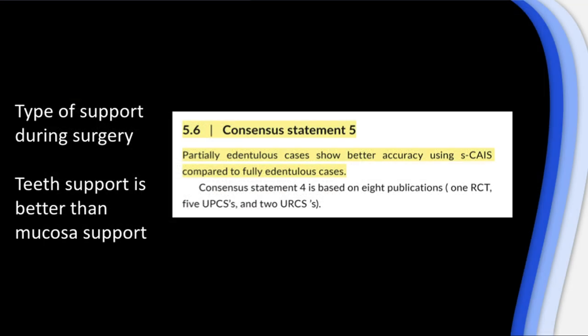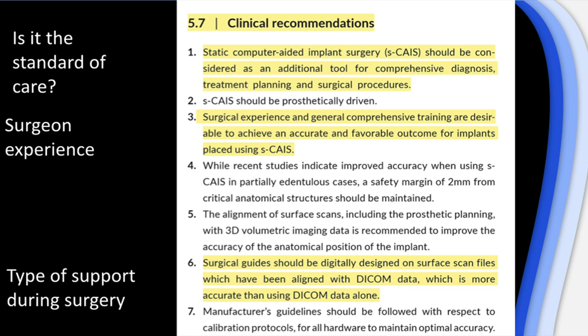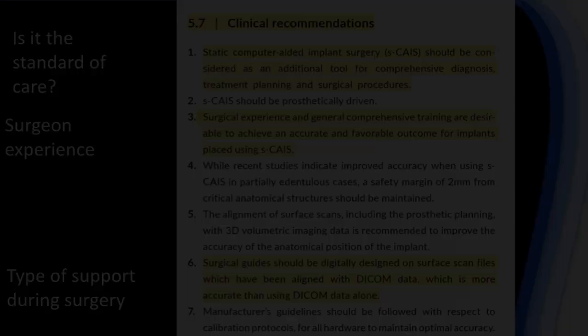Also, the type of support during surgery is another factor which dictates the degree of accuracy. It is well documented that tooth-supported guides offer more accurate results than mucosa and bone-supported guides. It's recommended that the surgical guides should be digitally designed on a surface scan model rather than on DICOM data. Moreover, the surgeon's experience is also another factor. Expert surgeons achieve more accurate results, especially in partially guided surgery.